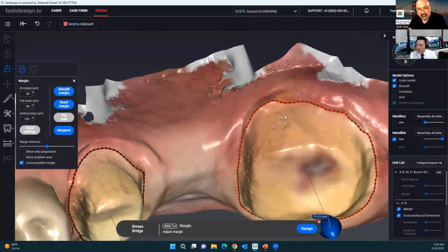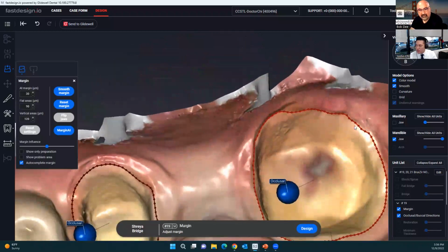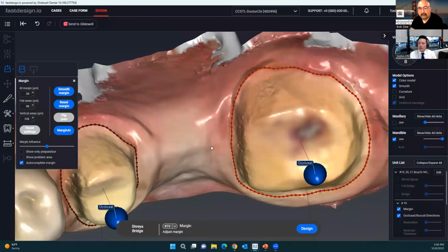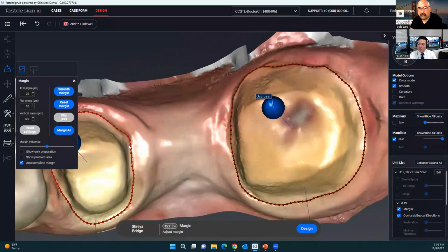So here on the, yeah, I'm going to interrupt you. So Sure. basically, because number 18 had moved forward, you call this 19, 20, 21 to for the AI to actually create a premolar instead of a molar because you don't have a space for molar. Is that what you were saying?